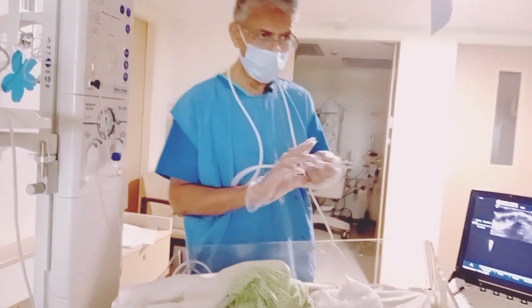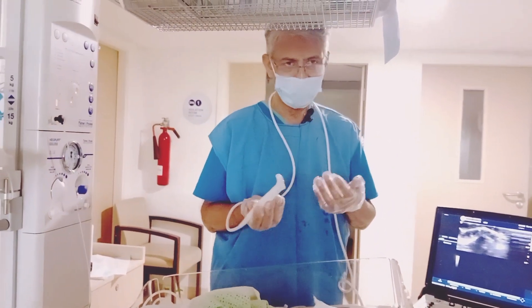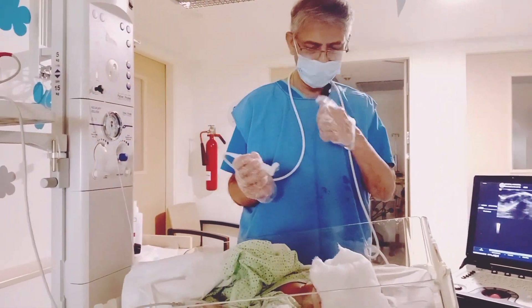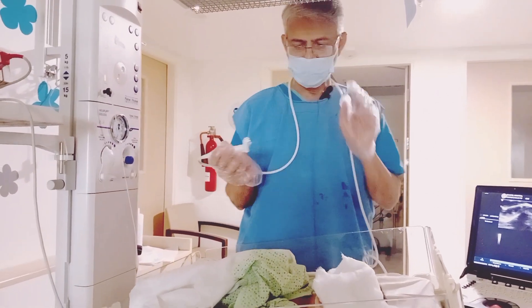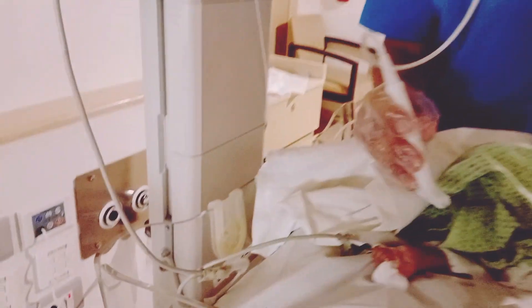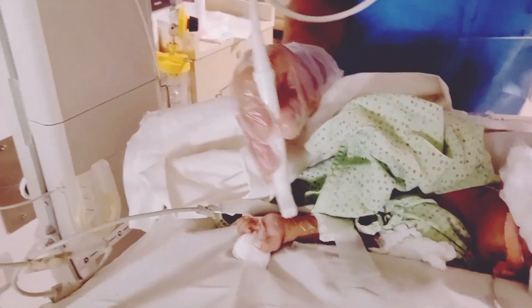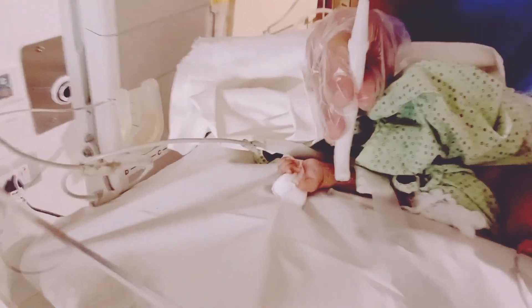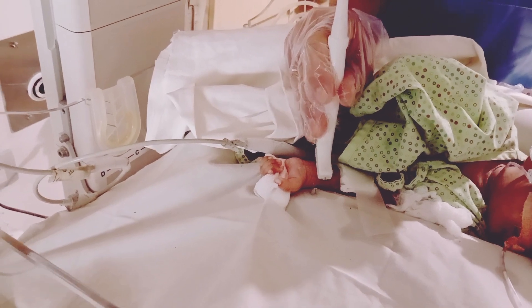There are two important views we take: the transverse view and the sagittal view. I will demonstrate how the artery looks on the transverse view. This is how you place the arm — just above the styloid process.